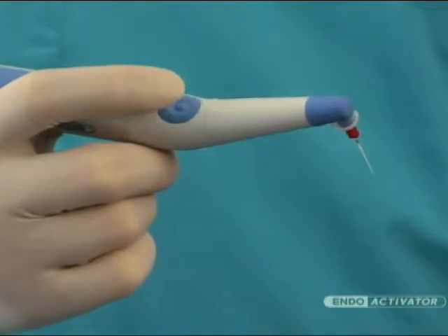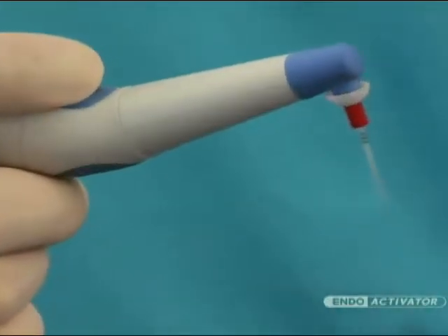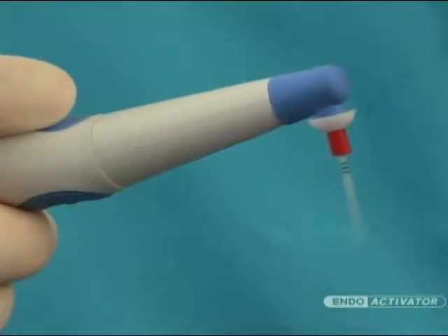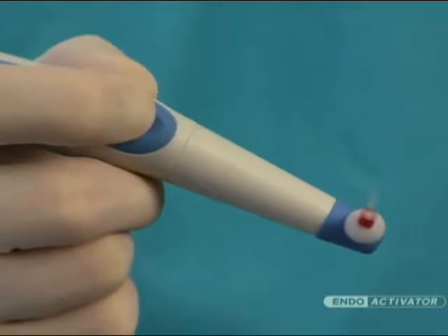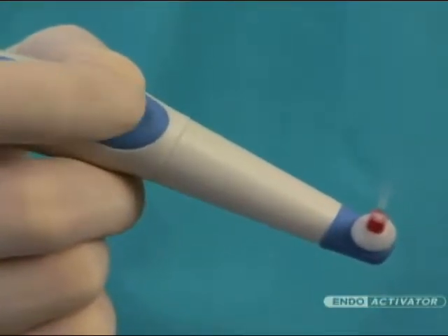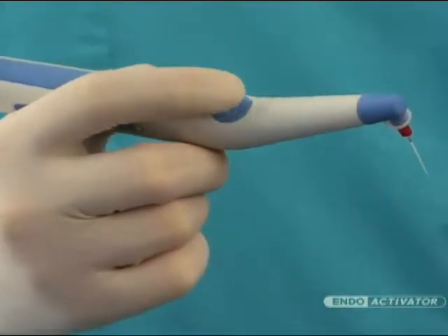This handpiece is operated by pressing the light touch on-off switch, which activates the strong and flexible polymer tips. The three-speed sonic motor switch provides options of 10,000, 6,000, and 2,000 cycles per minute.